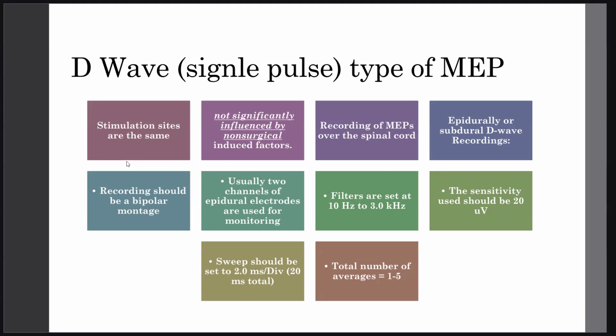Dr. Adai talked about patients with SMA, patients who have neuromuscular disease. Neuromuscular means the peripheral part. Those patients with a neuromuscular disease, not a small proportion, a good proportion of them will have spine deformities. They will have, let's say, a tendency to form tumors in the CNS. Those patients are better monitored with D-wave responses. Why? Because you bypass these problems: muscle atrophy, myopathy, degenerative change, fatty fibrosis of the muscle. You will even bypass the defective regenerative neuromuscular junction. For example, SMA is denervation, reinnervation. You will bypass these and directly take the response from the CNS.